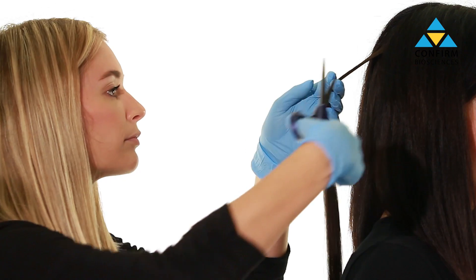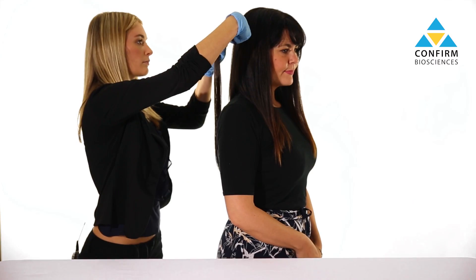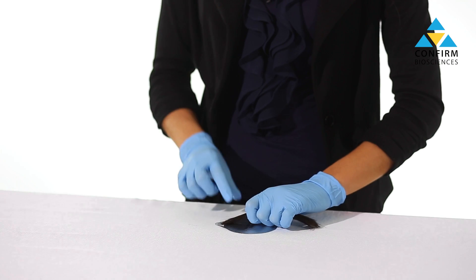Cut the hair sample as close to the scalp as possible. Hair can be collected from different parts of the scalp. If there isn't enough hair on the donor's head, body hair can be used as an alternative — collected from the arms, underarm, chest, and pubic areas. When using body hair, submit double the amount, as body hair is thinner than head hair.